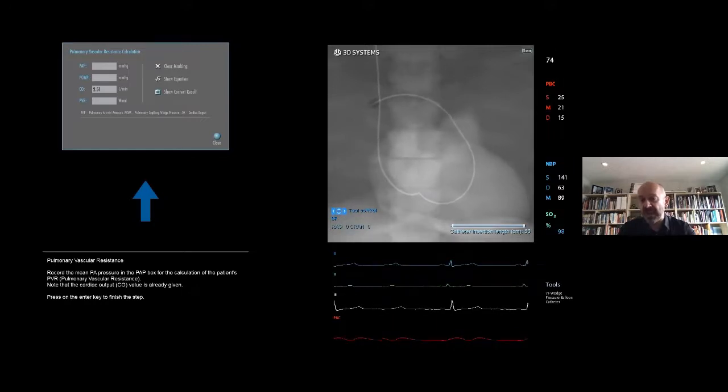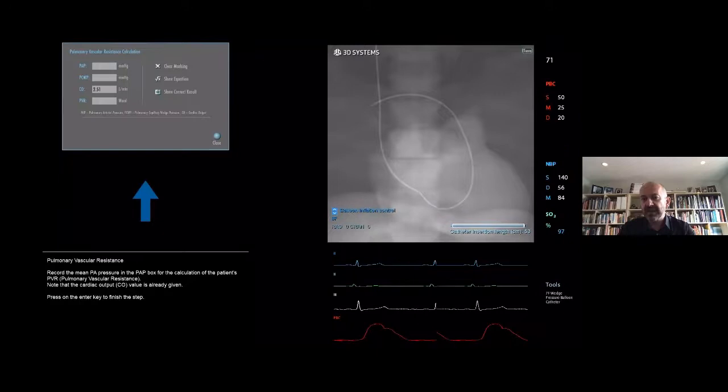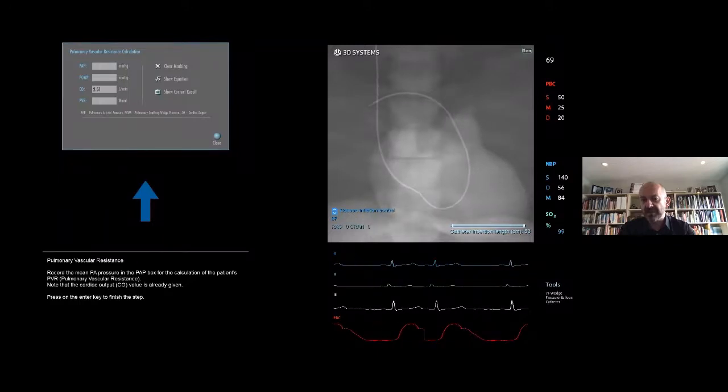All right. So now you want to confirm, is this really what I think it is? Again, you don't have fluoroscopy. So what you can do is deflate the balloon right now. Nitzan's going to deflate the balloon. Take a look at what happens when you deflate the balloon. Don't pull it back, just deflate the balloon. And see how the balloon went down and the pressure went up.